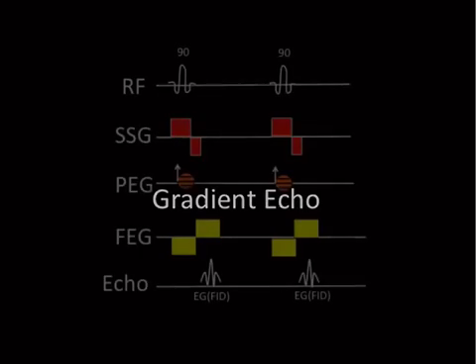Okay, so now we're moving into the category of the second major type. Gradient echoes are not spin echo sequences, they are gradient echo sequences. So this is like red states and blue states, or Coke and Pepsi, or whatever. They're two radically different things. Not that radically different, but they are different.